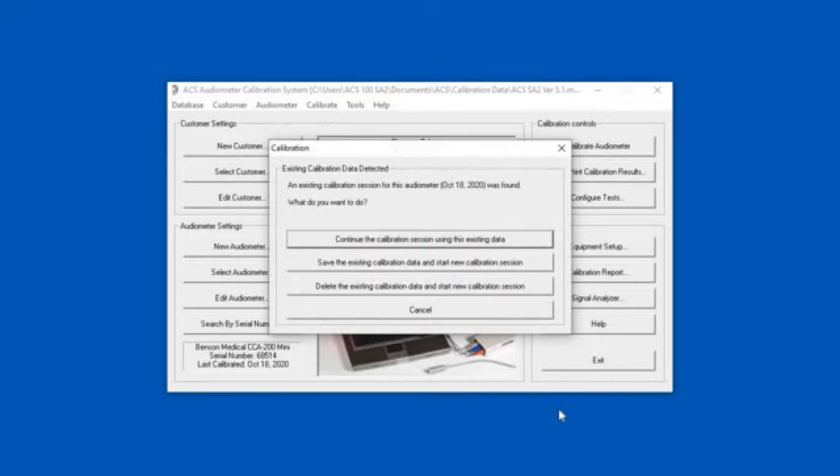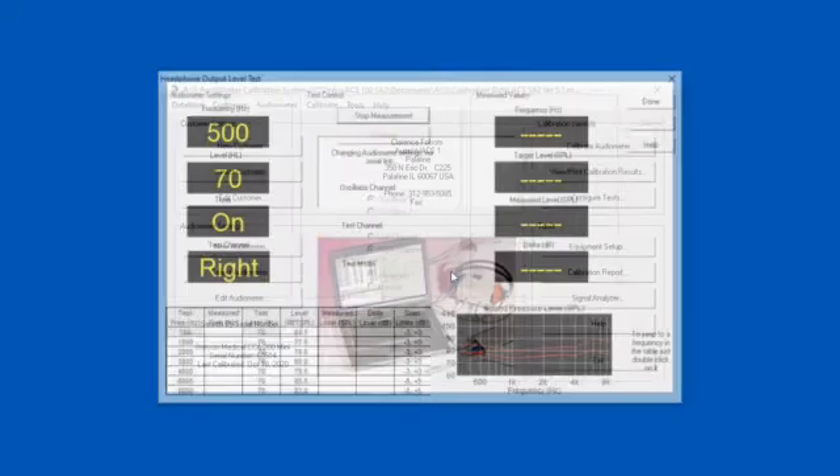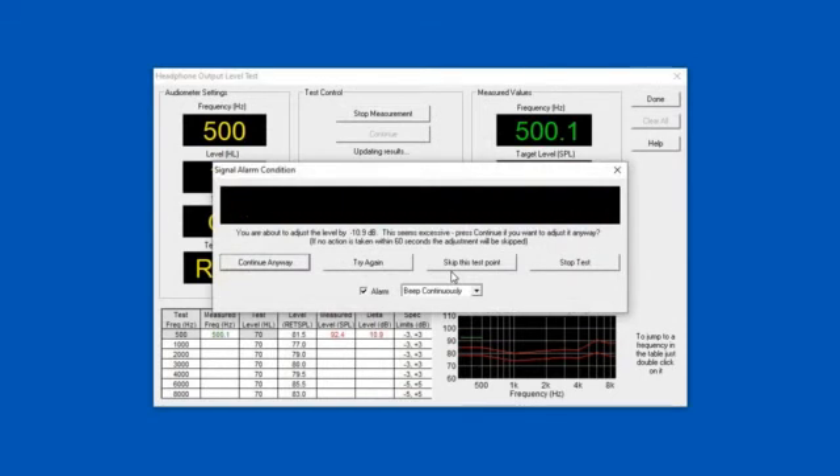It's asking me: do I want to continue an old test, or start a new test? Most of the time you're going to start a new test. It asks for some help by saying, put the microphone and coupler on the right headphone, which I have done. Press OK, and away we go. Right away the instrument is telling us we're 10 dB out of calibration — that's pretty unusual for an audiometer to be that much out right off. You'd want to check the patch cords, connections, and headphones. But I deliberately tipped the coupler off to get it out of calibration, to show you this screen.